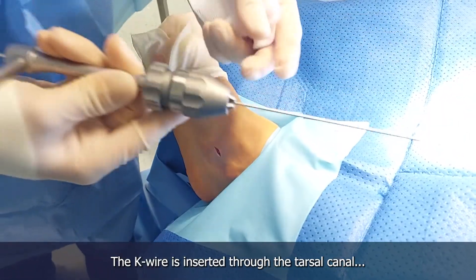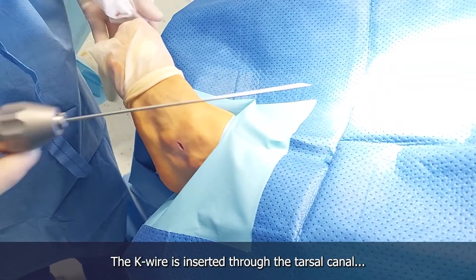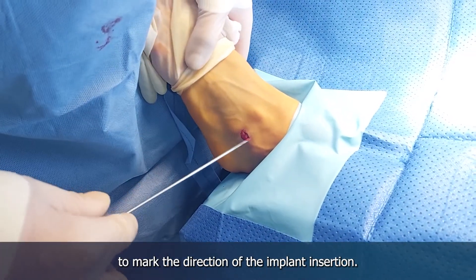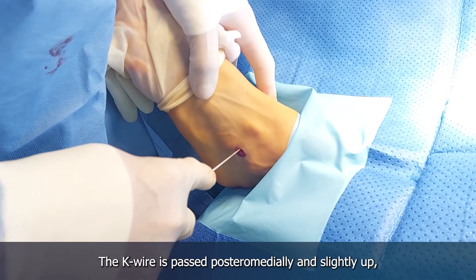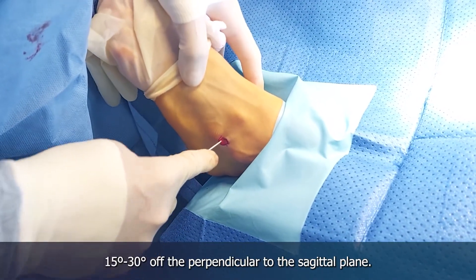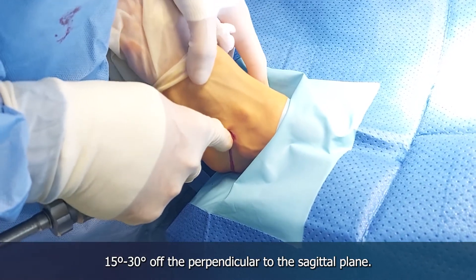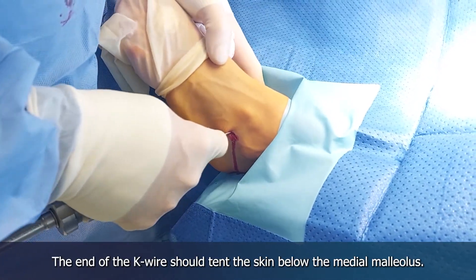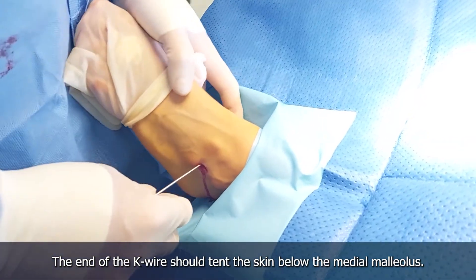The K-wire is inserted through the tarsal canal to mark the direction of the implant insertion. The K-wire is passed posterior medially and slightly upward, about 15 to 30 degrees off the perpendicular to the sagittal plane. The end of the K-wire should tent the skin below the medial malleolus.